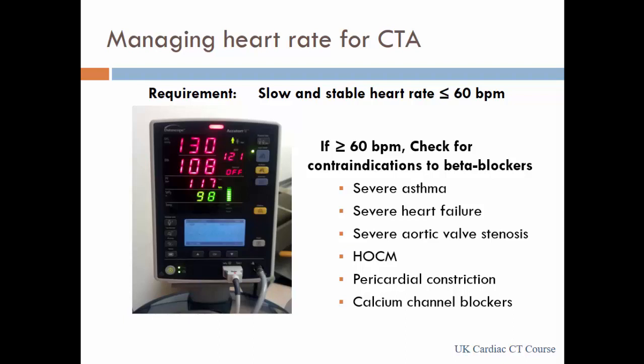So patients with severe heart failure, severe aortic valve stenosis, so patients coming for TAVI assessment, we do not give them any beta blockers. Or obstructive. Severe heart failure, sorry. I understand not in acute pulmonary edema, but all patients with severely impacted function having beta blockers, of course. But to what extent though?